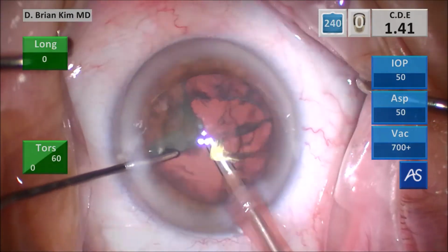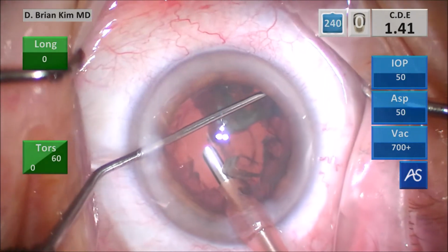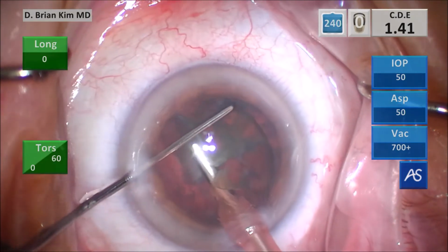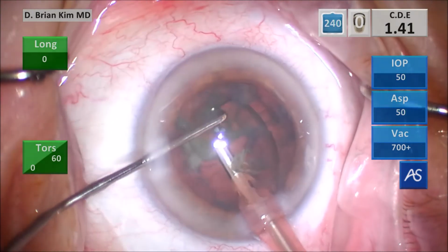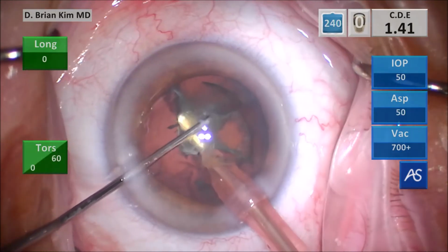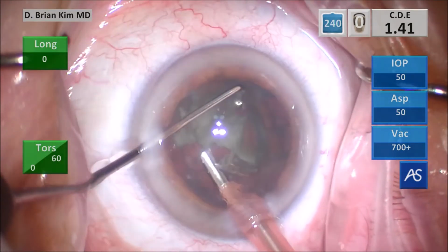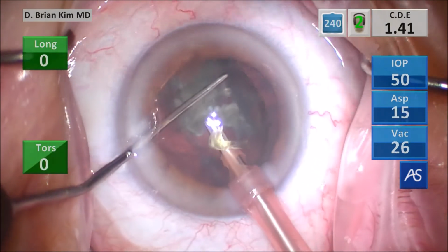Rotating the fourth quadrant in front of me, placing the chopper under the lens, around the lens, placing that phaco tip deep. You see, when I do that, I can feel that I don't have it. And that's why I stop. You see that when I bring the instruments together and it just slides, and you saw that I stopped and I had to start again, that means that I didn't feel that resistance that I'm referring to.